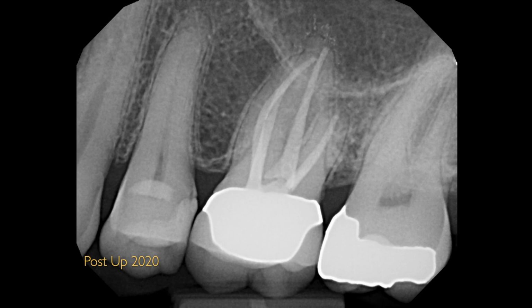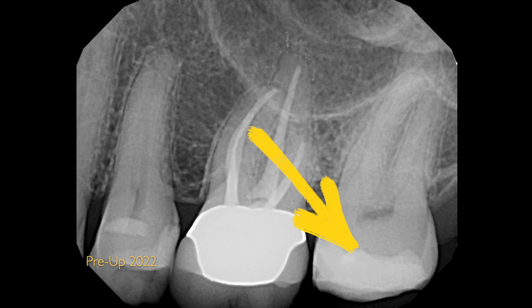But his sensitivity in the maxillary second molar did not end here. After replacement of the amalgam filling that he had in there and placement of a bonded composite, the pain to cold as well as the chewing continued. I assumed that there was maybe a small crack underneath the original amalgam that was causing these symptoms, and the patient had continued symptoms in the tooth. Now, as you can see here, the pulp is far away from the restoration, but the symptoms were present, and I validated that clinically.